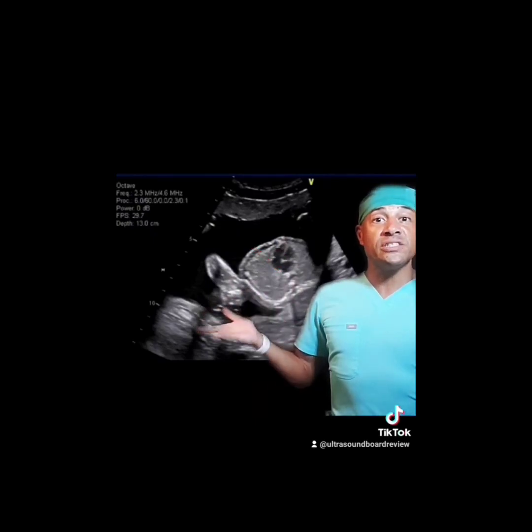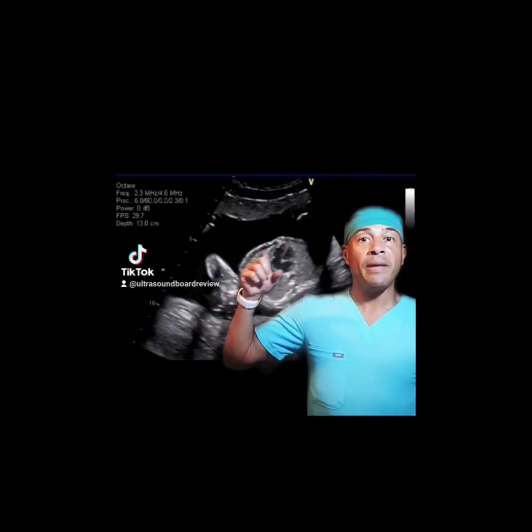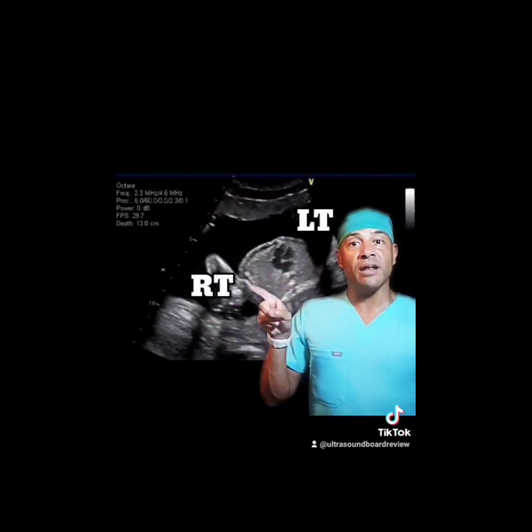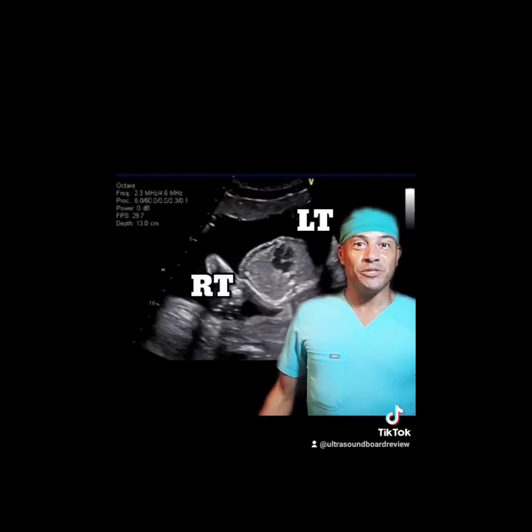Now, what presentation is this baby in? Well, if the apex of the heart is pointing towards the same side as the stomach, that means this is the left side if the spine's here, and this is the right side. That means this has to be a breech presentation.